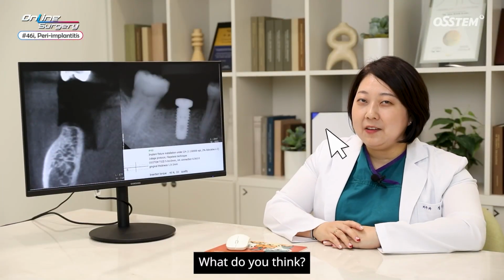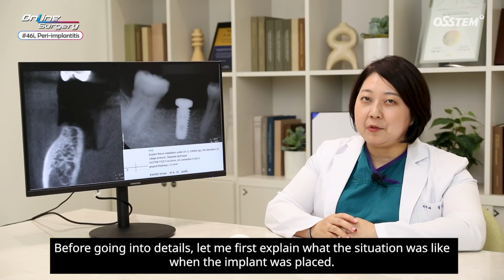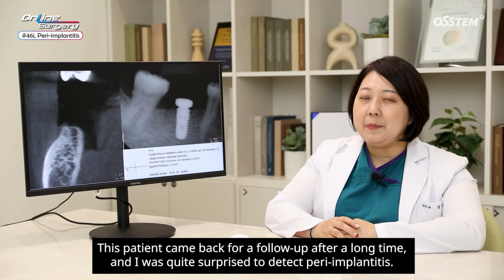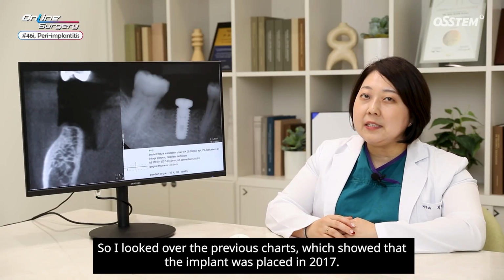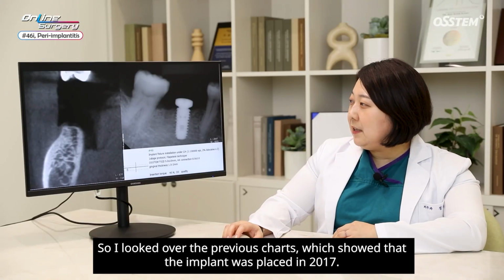What do you think? Before going into details, let me first explain what the situation was like when the implant was placed. This patient came back for a follow-up after a long time, and I was quite surprised to detect peri-implantitis. So I looked over the previous charts, which showed that the implant was placed in 2017.